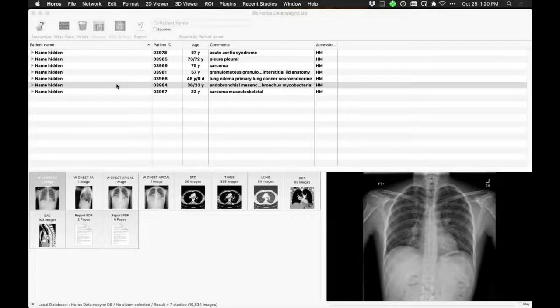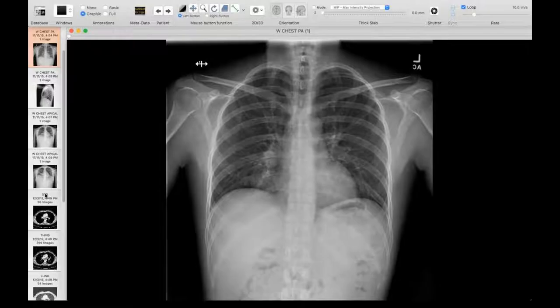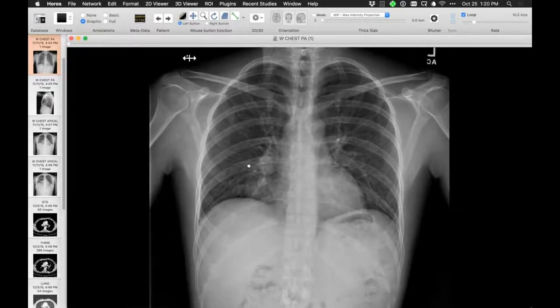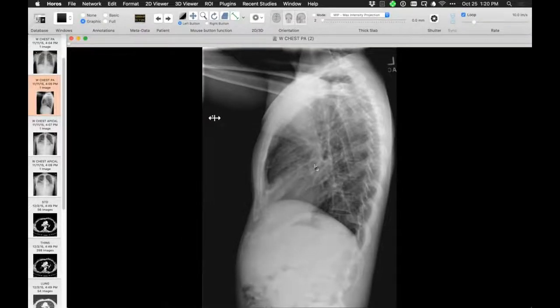This is a case of a thing that I have never heard of before — I've been practicing 30-35 years. Here is an image from a patient with abnormal opacity in relation to the right infrahilar region and some ill-defined opacity beyond it. There is abnormality in the right middle lobe. So we have a combination of an infrahilar abnormality and right middle lobe abnormality.